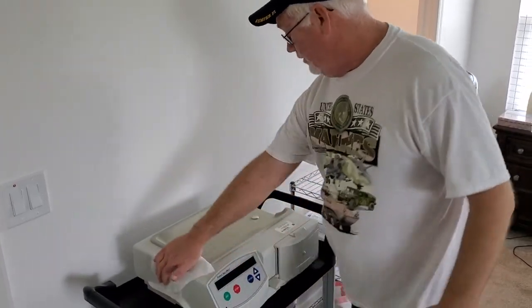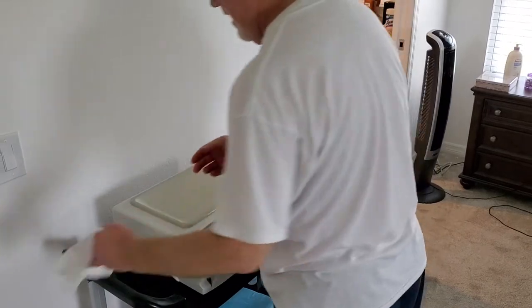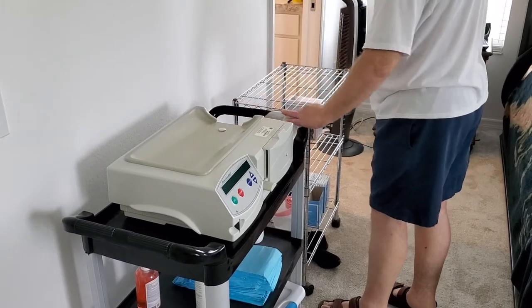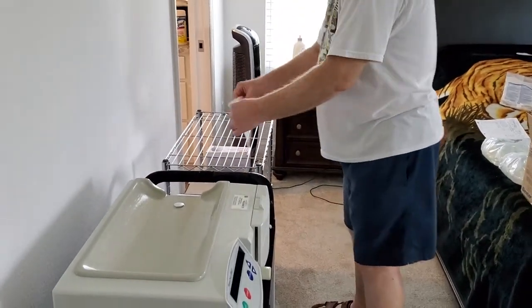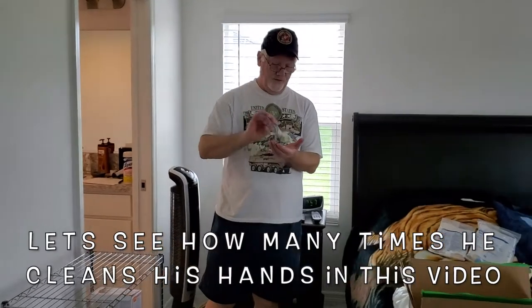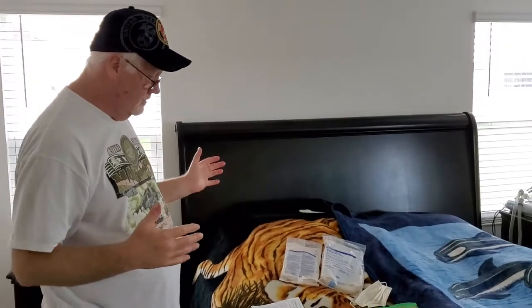I want to wipe the machine down real good, and also wipe down what it's sitting on — this is where the first bag is going, and on this little cart is where the second bag is going. Wipe it down as well. So our area is nice and sterilized. Before we gather any supplies, go ahead and sanitize your hands.